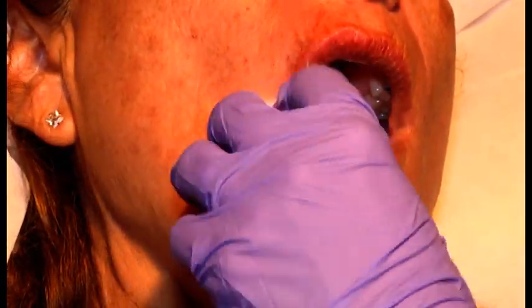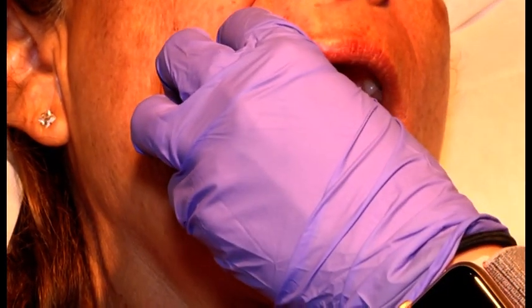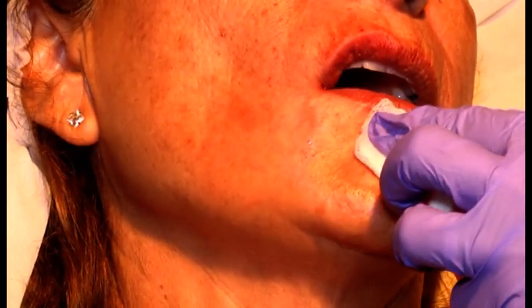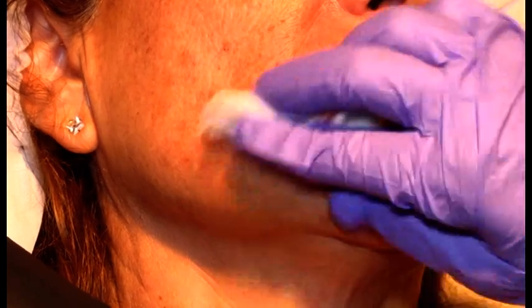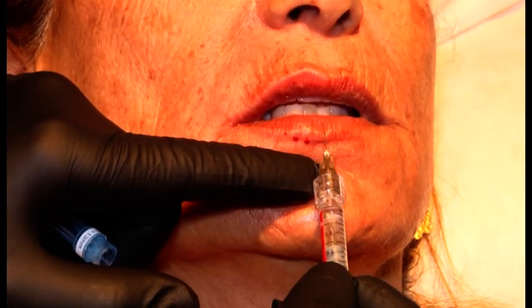And with her, I'm not going to inject a lot of product. I'm just going to inject a little bit because I don't want to overinflate her lips. To tell you the truth, it was Orit's idea to inject her lips. I did not really plan to do this.